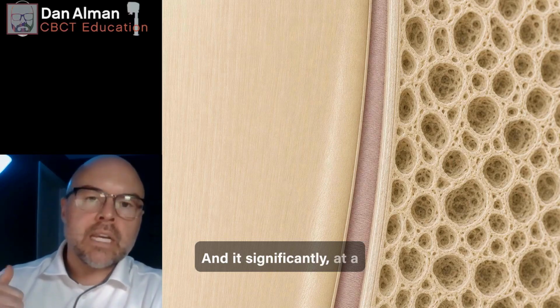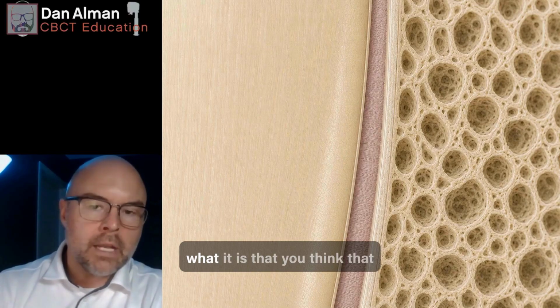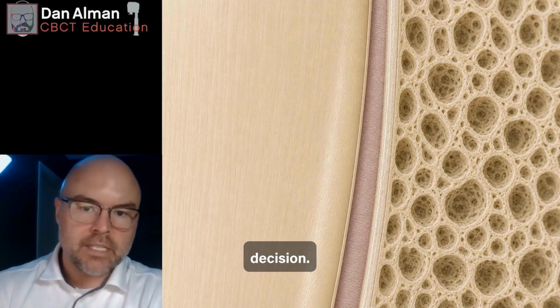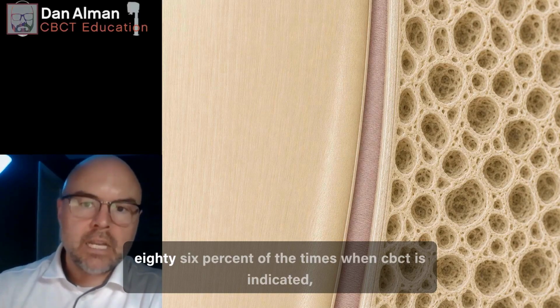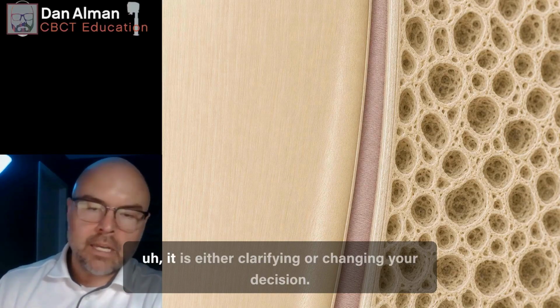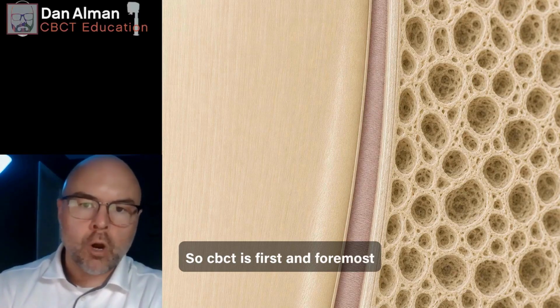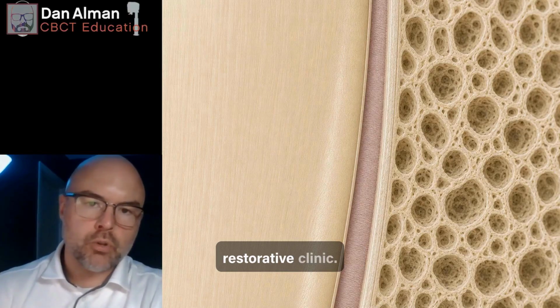This is where CBCT comes in, and it significantly, at a significant rate, clarifies what it is that you think that it is, or overall changes the decision. We're talking, in some studies, up to 86% of the times when CBCT is indicated, it is either clarifying or changing your decision. So, CBCT is first and foremost a tool for diagnosis in a restorative clinic.